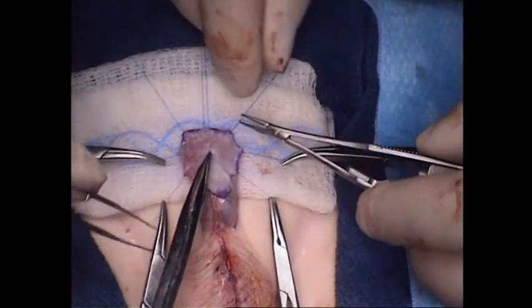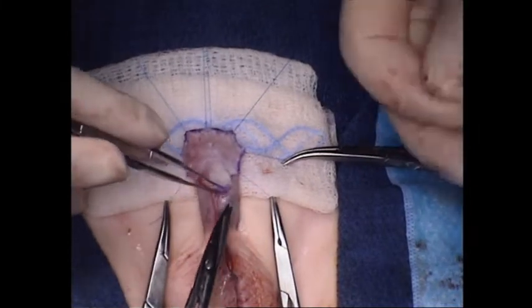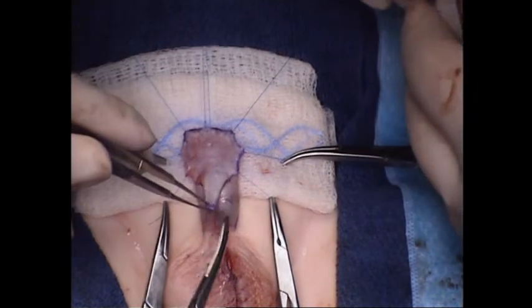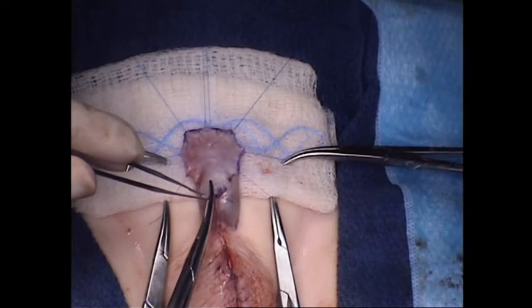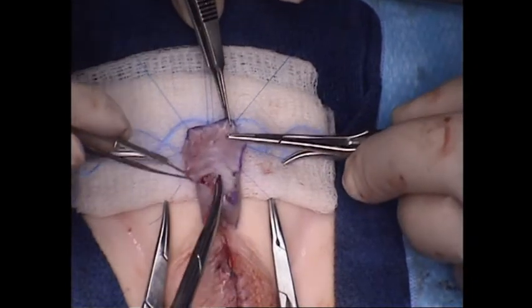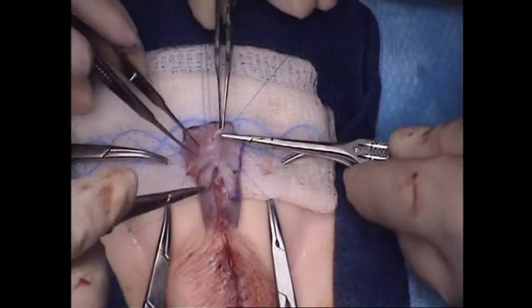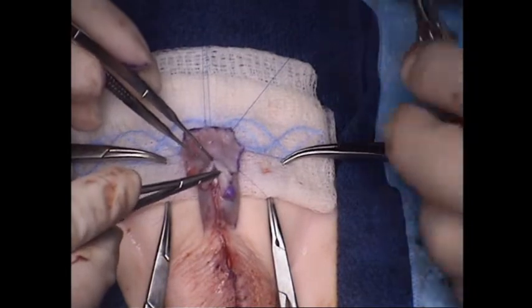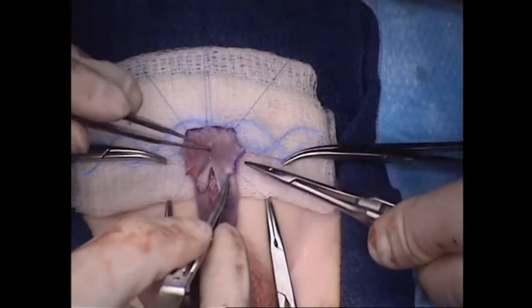And once he's got a fixation suture up here, at least in the midline, then I can go ahead and finish tailoring the graft, which I'm going to do right up here to the level of my proximal urethrostomy. So we'll just cut right in the midline to take us up to that level without putting undue tension on the graft. So we want it to just lay there without having to stretch it. And I will take the suture down to secure this portion of the graft to the corpora underneath.